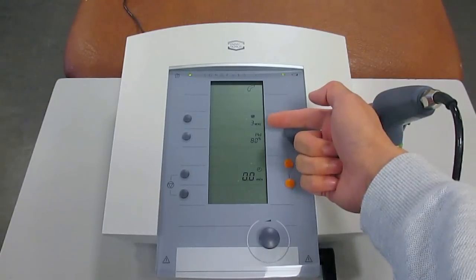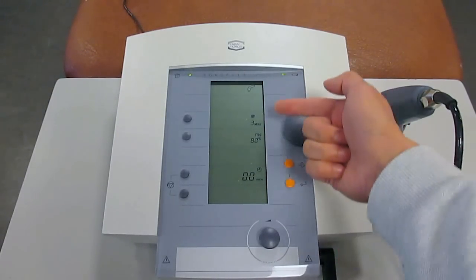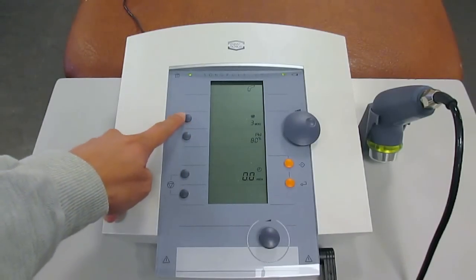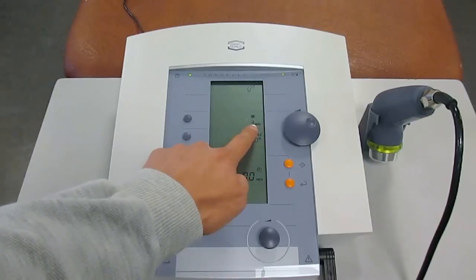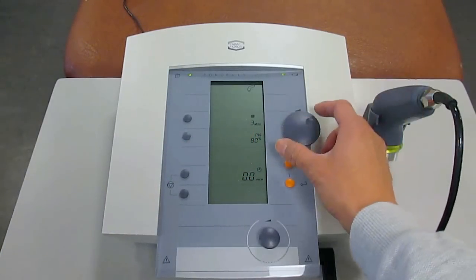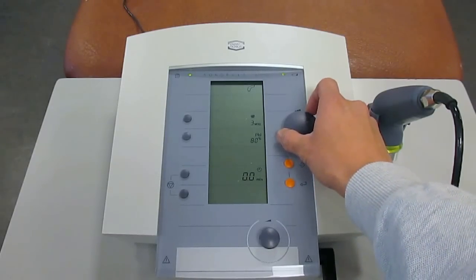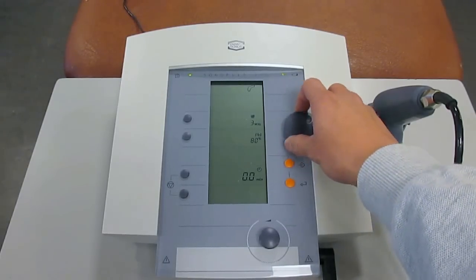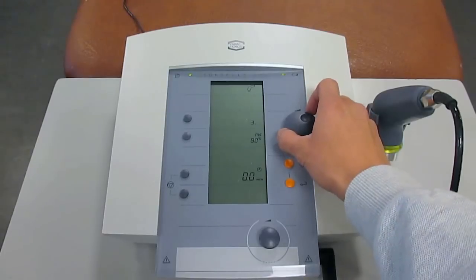There are several parameters that you can actually choose from for the ultrasound Sonopulse 490. The very first parameter we'll be interested in is this button over here. If you press this button, the parameter will start to flash on the LCD screen. You can use this big dial to change the parameter. This is the frequency of the ultrasound. For the Sonopulse 490, it offers you 1 MHz as well as 3 MHz pulse settings.